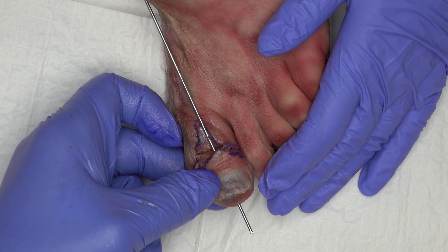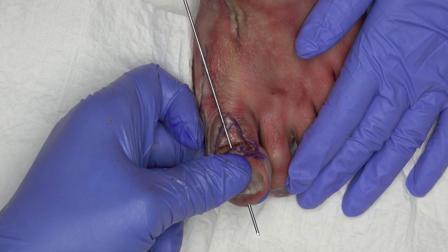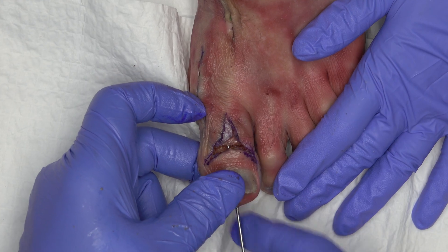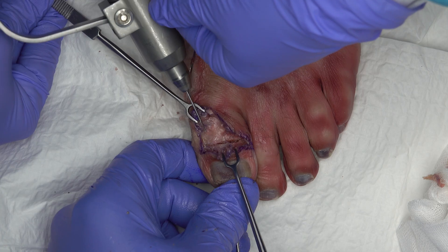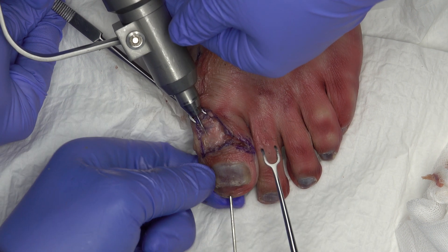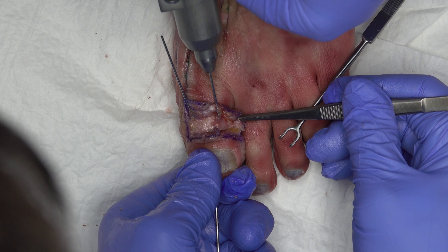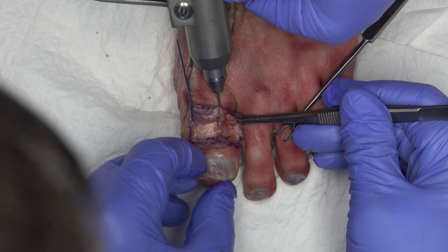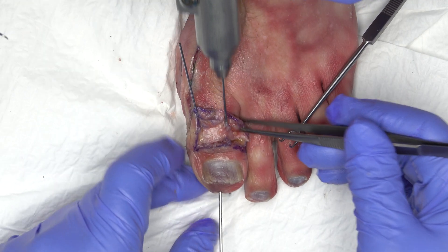In the optimal position, transfixation of the IP joint is performed with the 1.6 mm K wire, which is inserted through the trochlea deep into the shaft of the proximal phalanx. In addition, temporary fixation of the IP joint is performed with two 1.2 mm K wires. These K wires hold the position of the IP joint stable during drilling and tapping, so that the drill channel can no longer slip until the Shark Screw is inserted.